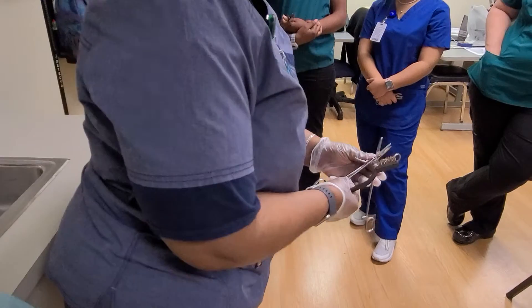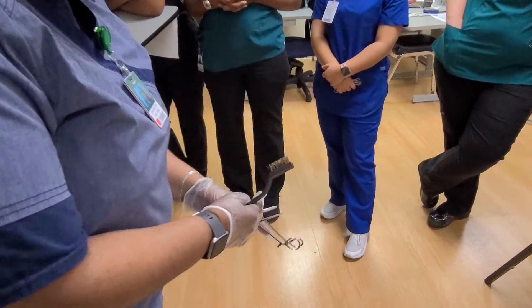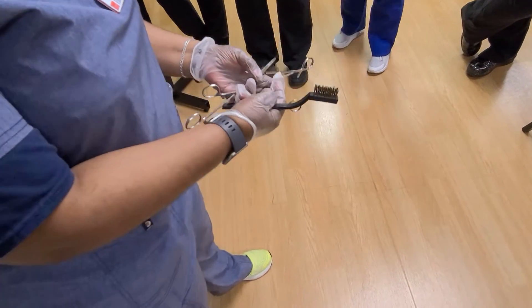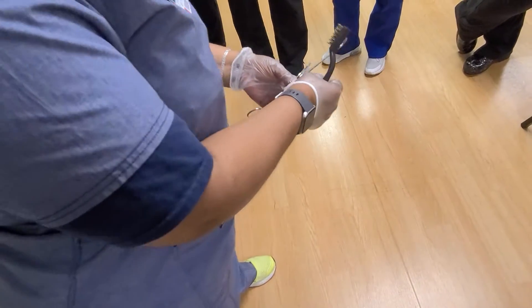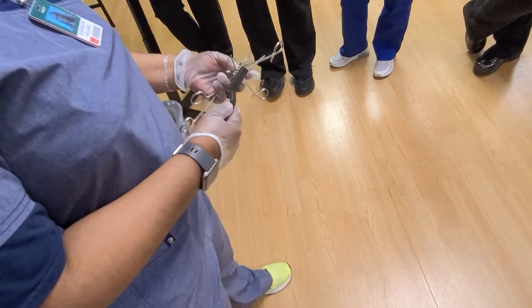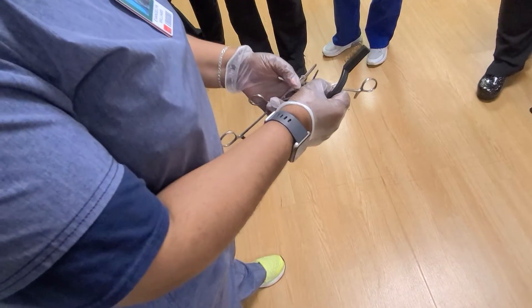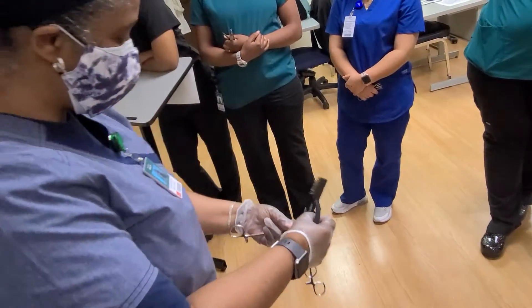I want you to see something — notice with the needle holder, it's a little bit flat. But this one, which is my straight Kelly hemostat, it has grooves in here. Can you tell me what those grooves are called? Serrations. So I'm going to sanitize this instrument, but I just wanted you to see the difference.